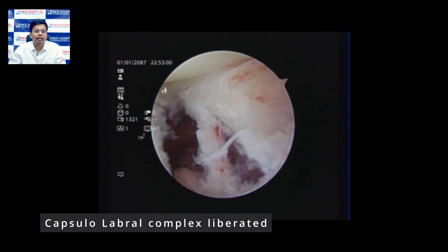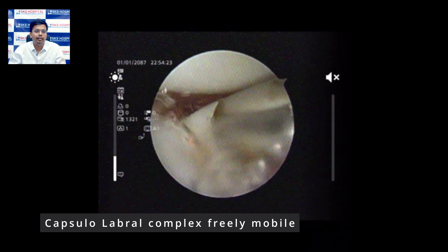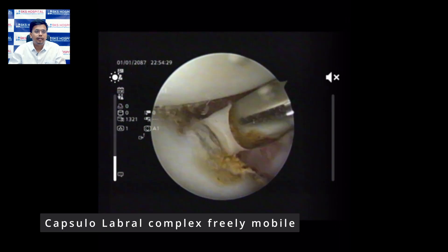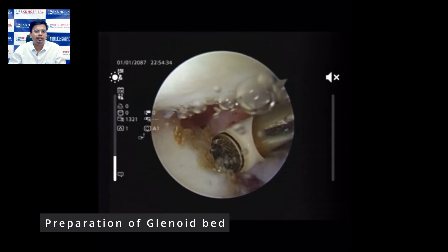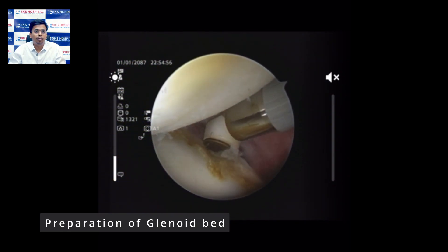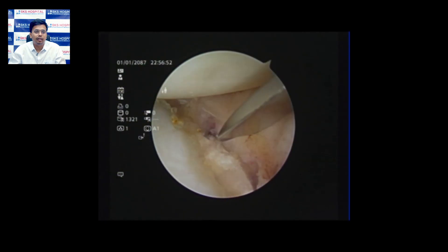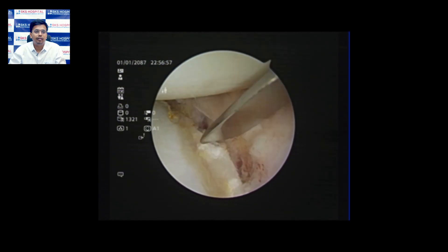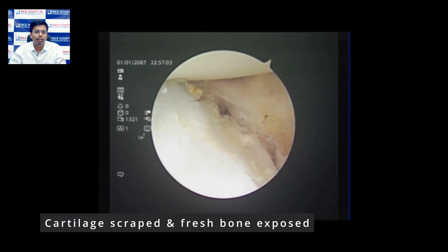The capsulolabral complex has now been properly elevated and separated from the glenoid, and we proceed to prepare the glenoid bed. We use a radiofrequency ablator to remove a small amount of cartilage from the glenoid bed to expose the raw bone. The liberator is then used further to expose the raw bone, which is the ideal environment for the capsulolabral complex to heal.